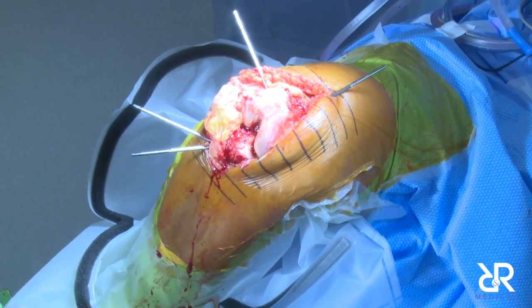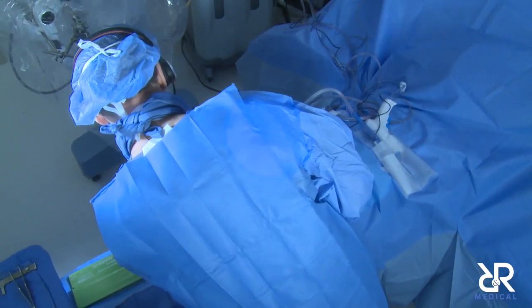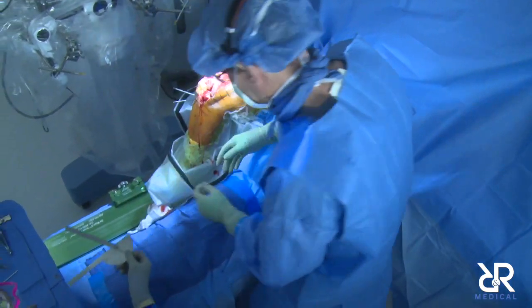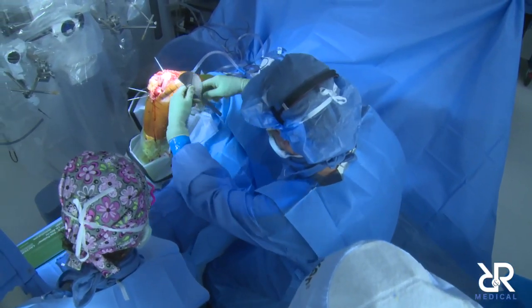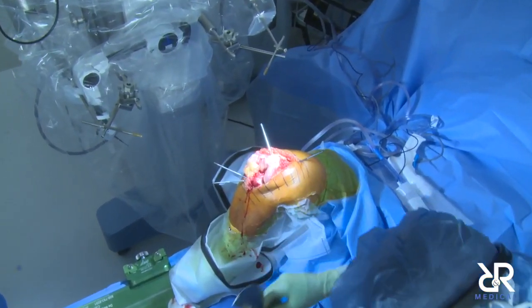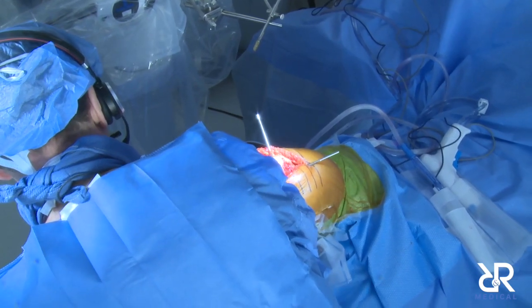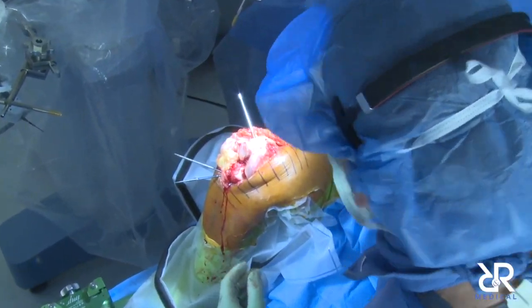So right now we're bringing the robot in. Yeah, no, we have great help here. So the key is to flex the knee at least 120. So we're about 110, maybe a little bit more. All right, bring the robot in.